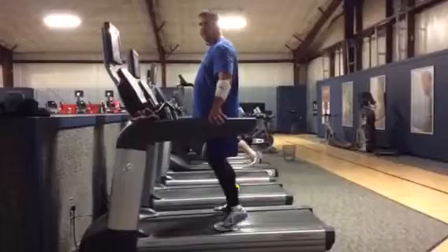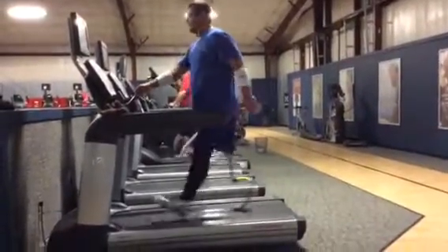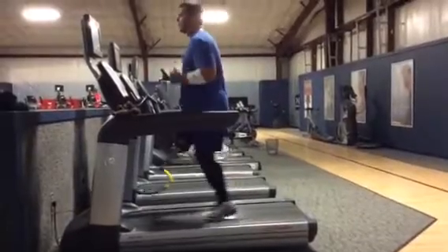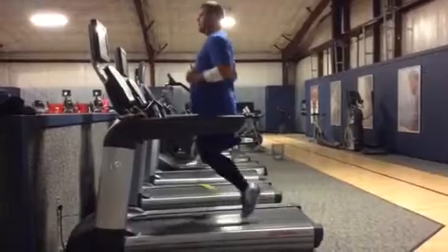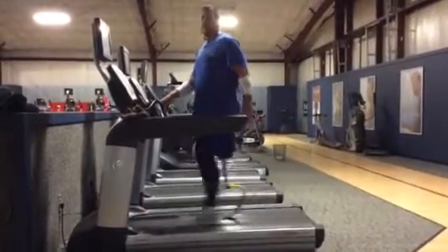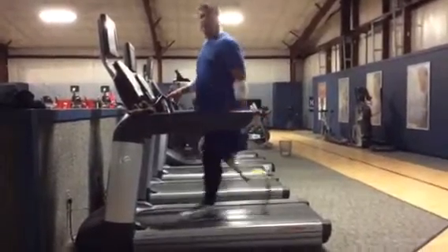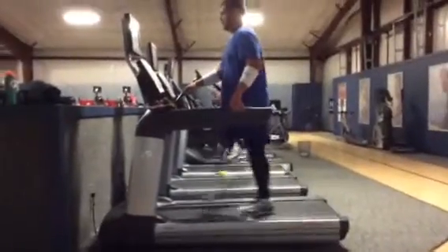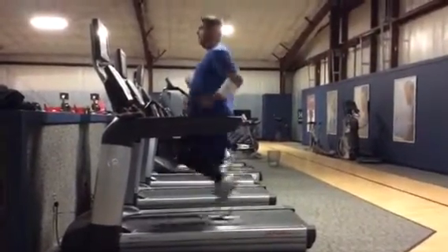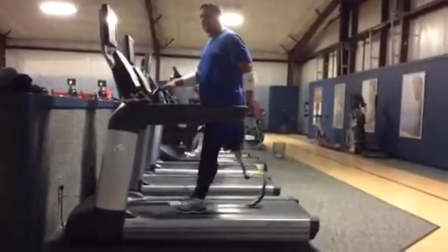Alright. Start at about 3 miles an hour with a walk. You can start jogging from this. Take it up to about 3.5. You really have to load that toe every time. Drive that thigh backwards. Same thing with this. You have to use intervals in order to build up strength and stamina to go any sort of distance. Alright, we're going to take it up this time to about 5 miles an hour. Take it back down and walk.